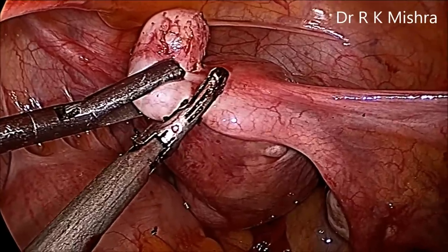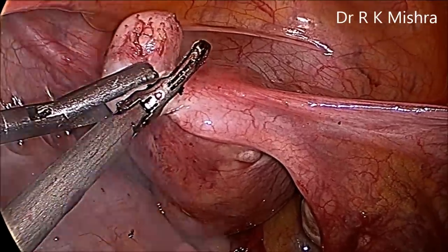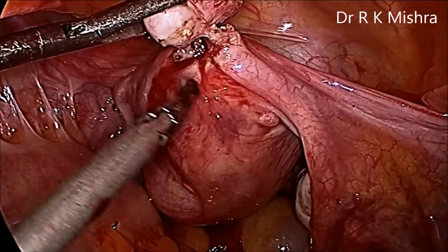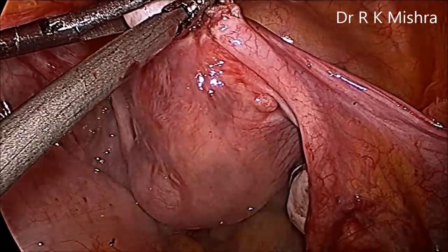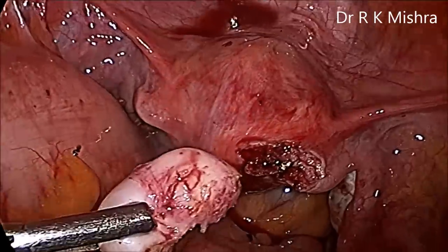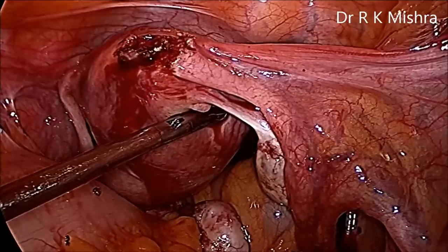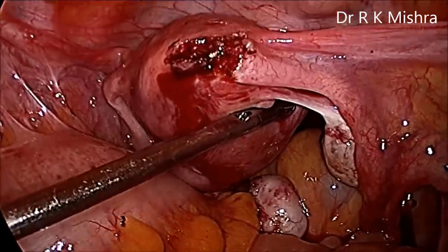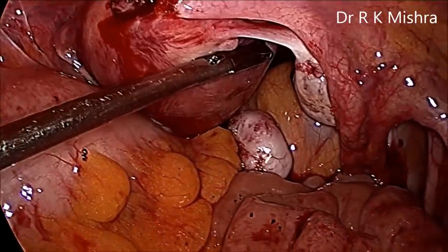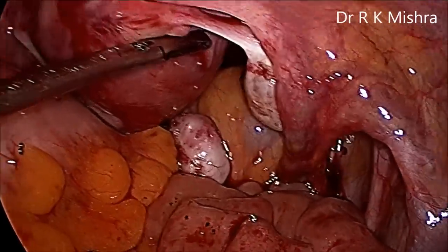This fibroid is also almost separated. After removing this fibroid, we again performed the tubal patency test to make sure the tube is patent and there is no leak at the level of the cornual end. The fibroid is out. Now the tubal patency test with the HSG cannula — methylene blue dye is injected. One grasper is keeping it up, and at the fimbrial end you can see the bubbles coming with the fluid, which means the tube is patent without any leak. This is very good — all the pressure over the tube has gone.